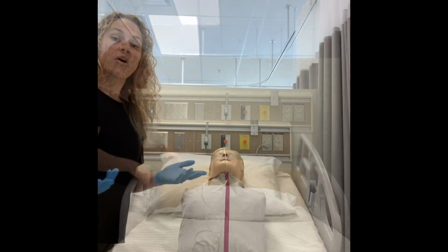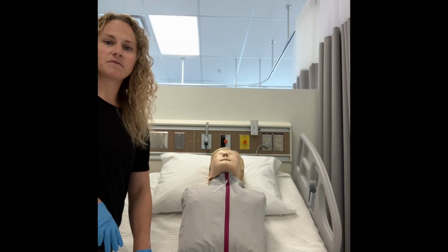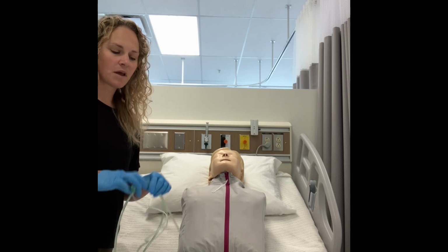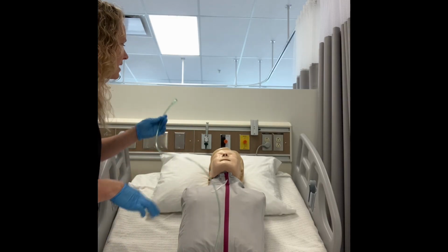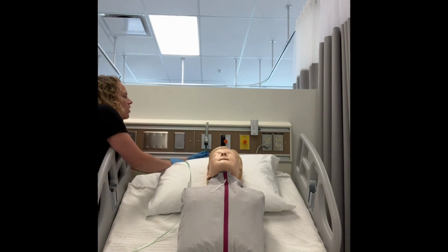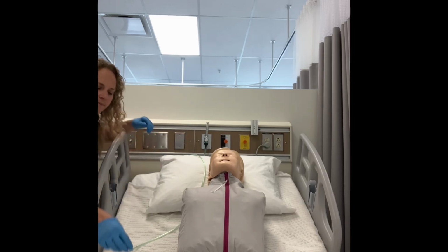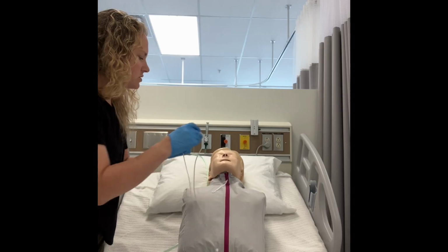different piece of equipment. There are 4 different delivery devices that we show students to deliver oxygen to a patient who is breathing independently. The first of those is a nasal cannula. A nasal cannula connects to the oxygen flow meter by a tubing to the tree. Okay? And then you apply these prongs into the nose.